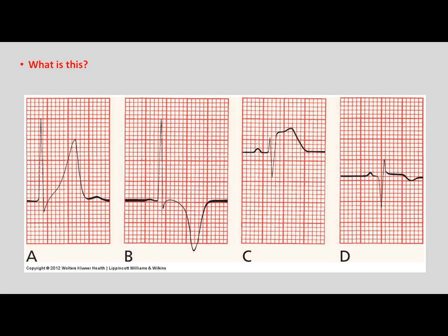Okay. So this is T inversion, which can be due to second phase of ECG changing and ST elevation. What do you have here now? What's this? Q wave. Why do Q waves form in heart attack? Because that part of the heart muscle is dead. Therefore, electrical forces are going in the opposite direction.